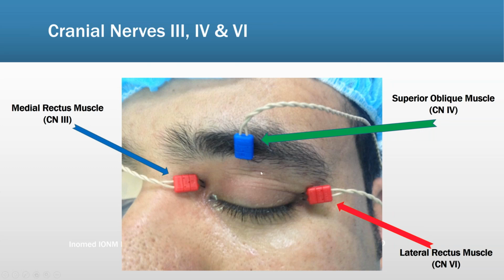You have to make sure you have experience in that, and don't try without having some experience done with a senior neurophysiologist. You have to push the eyeball to the side before putting the electrode, and you put the electrode away from the eyeball so it doesn't penetrate the eyeball.